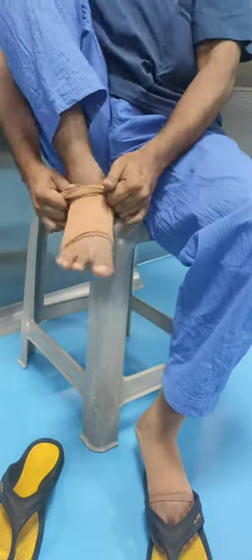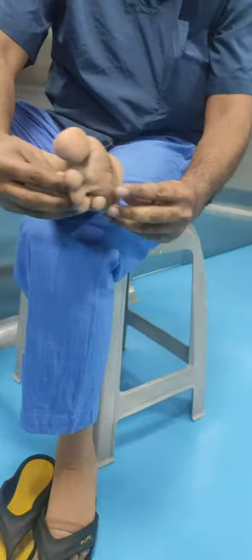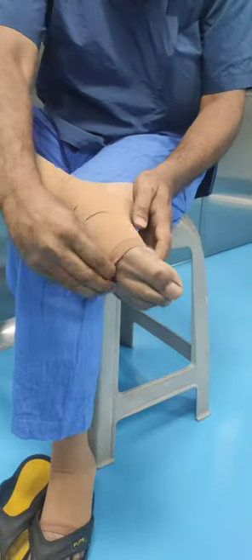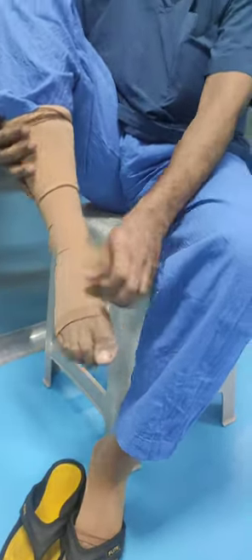Then hold the knee end and pull it upward. Adjust at the toe level — catch a fold of the stocking at the heel and pull it upward so that the heel sack comes and adjusts at the heel level.